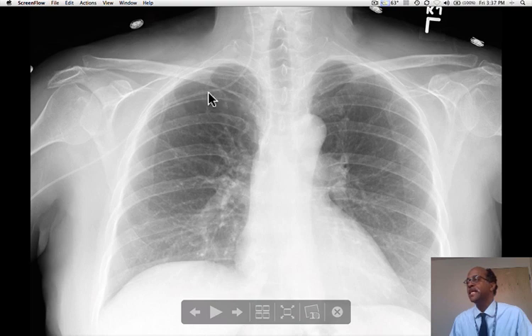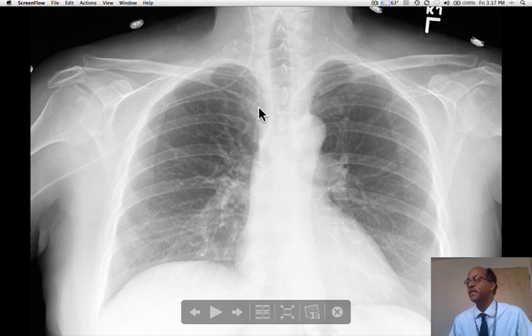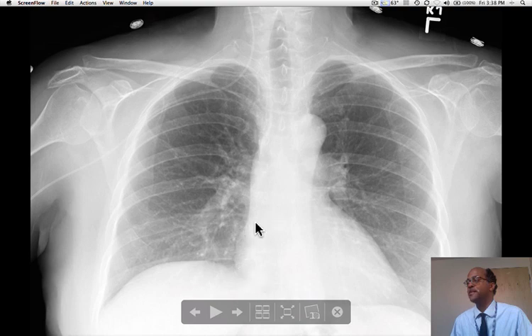The tip of the PICC line should be in the superior vena cava, anywhere between the confluence of the brachiocephalic veins and the cavo-atrial junction. Here is the right atrium, and this is where the superior vena cava meets the right atrium.